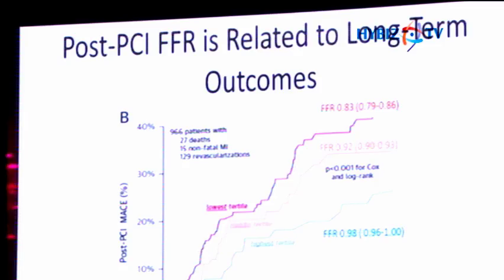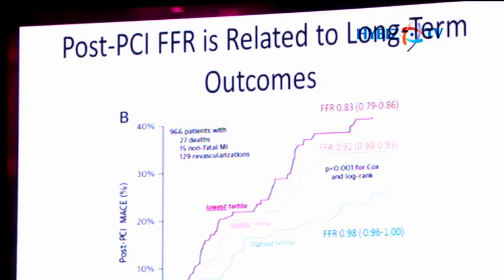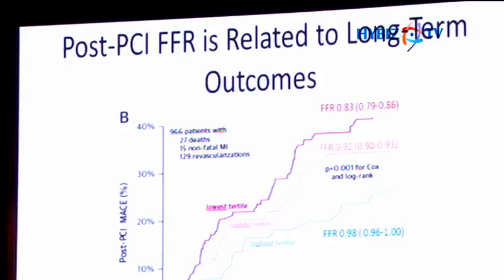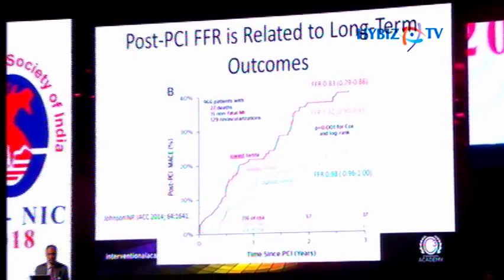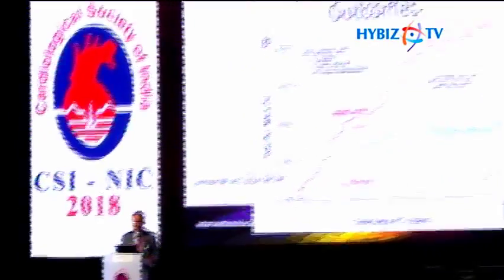shown here. A last concept before I conclude is, should you measure the FFR again after your PCI procedure? There are many reasons why FFR could be low, and in the interest of time, I'm not going to go into a deep discussion of why it could be. However, a post-PCI FFR is also a very important measure that you should consider doing, because those patients who have a high post-PCI FFR, you can see in the outcome difference, have a much better outcome than the patient who continues to remain low FFR.